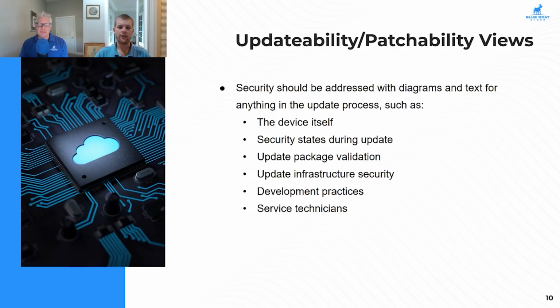There's a lot that can go into this, and the considerations can actually go pretty deep when you're considering this all the way down to the manufacturing level. Yeah, one of these that stands out for me, because I know we've been able to compromise devices in this way, is that second bullet there, the security states during the update. Because I know with quite a few devices, we're able to reboot the device and then boot off an operating system off of the thumb drive, which should not be allowed, basically, because then we can read whatever's on that system through the operating system off the thumb drive.